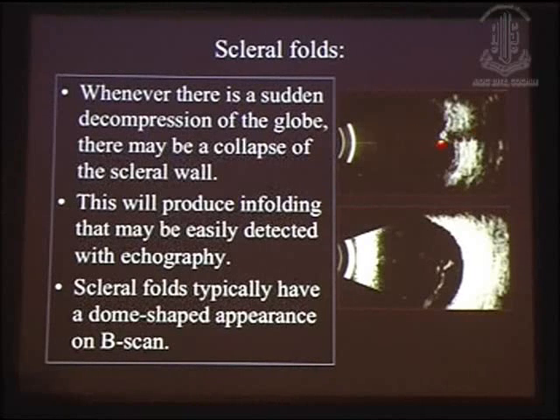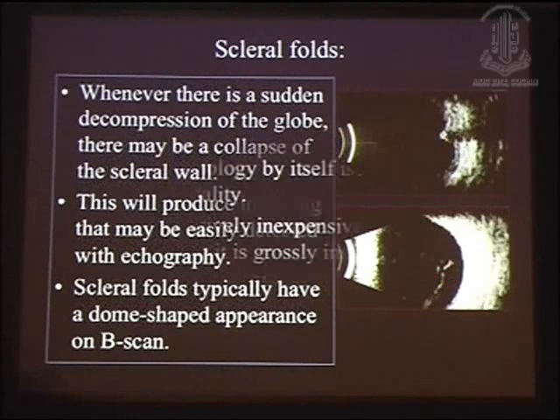Then we did the ultrasound after 1 week of that, after repairing of the exit wound. So entry wound, this diminution of this scleral fold you can see in the second slide.